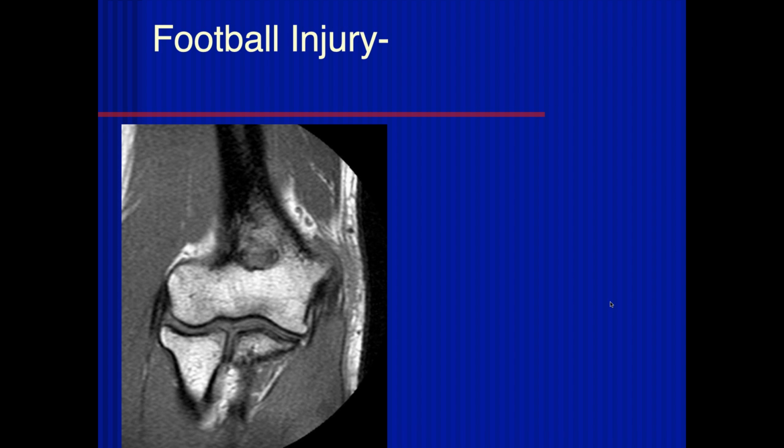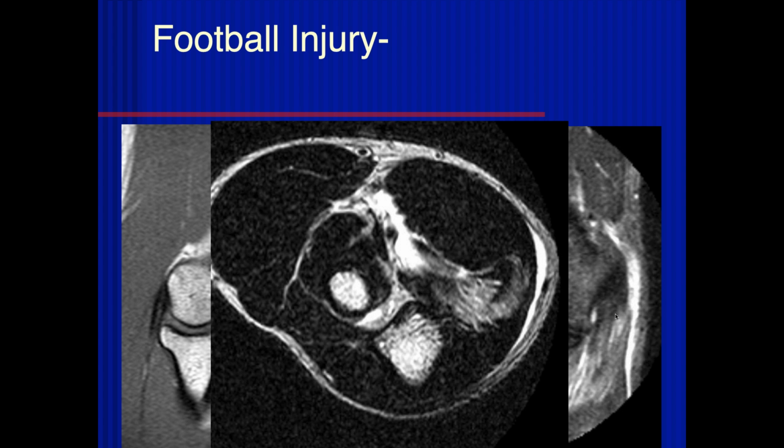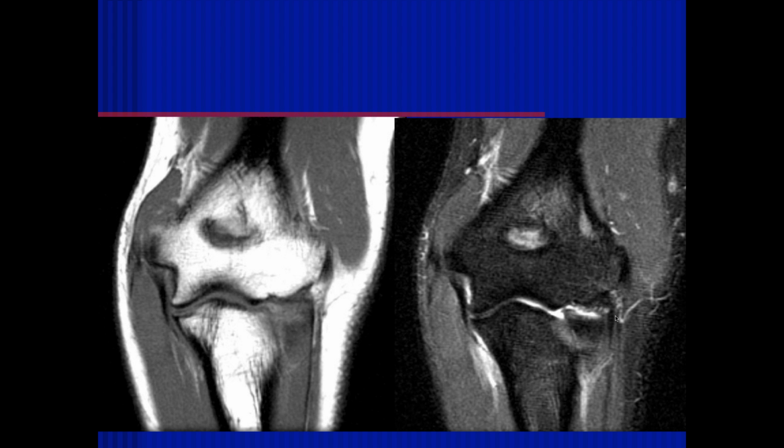Here's a patient where the muscle fails first. A football player with medial elbow pain. We can see a lot of soft tissue thickening and some increased signal intensity. On the STIR images, we can also see a lot of muscle tearing and hemorrhage into the subcutaneous tissue. Here, again, is a superficialis tear on the medial side. These are different examples of injuries from the same mechanism.